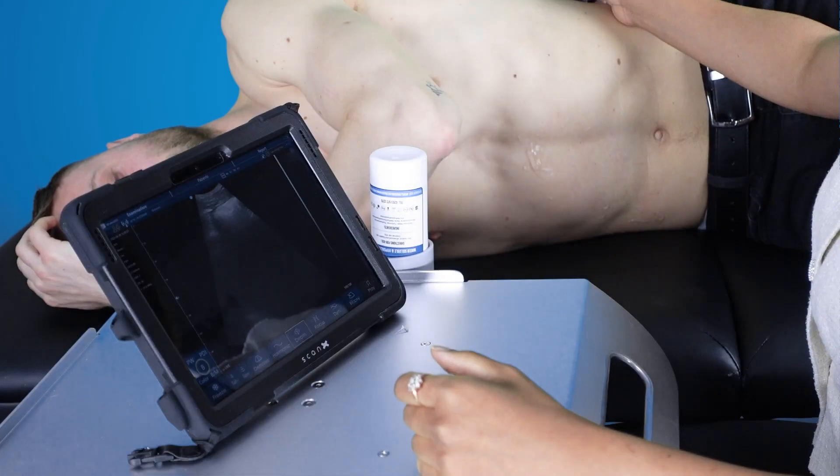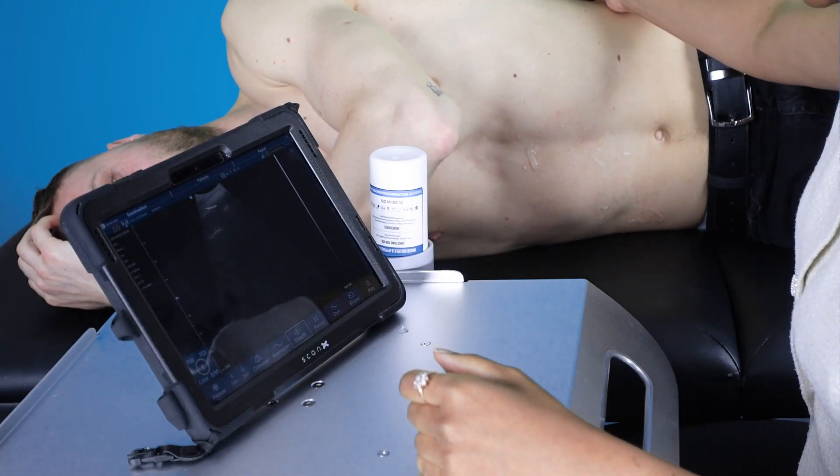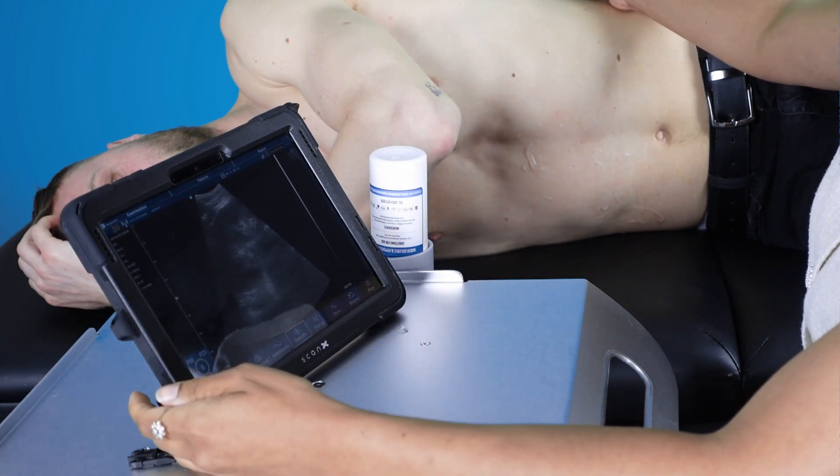This is my first time using ScanX Air portable probe ultrasound device. We have trialled this on the tablet and on the phone, so here are my first impressions.